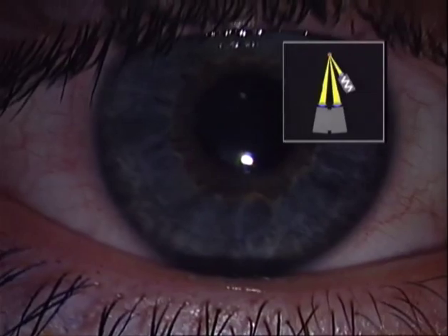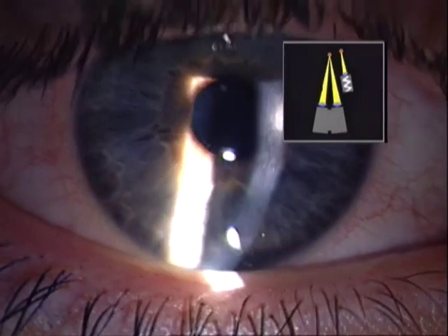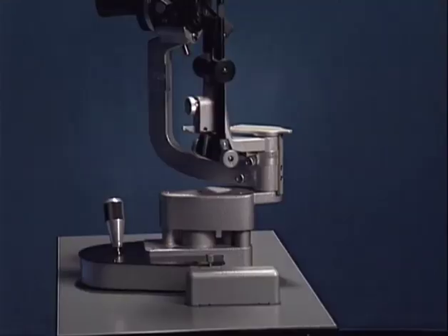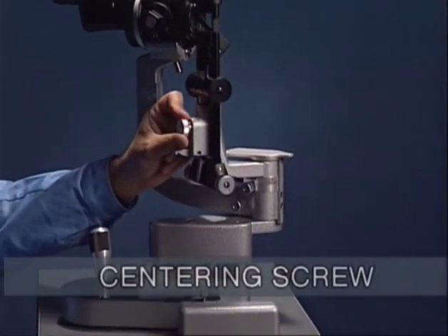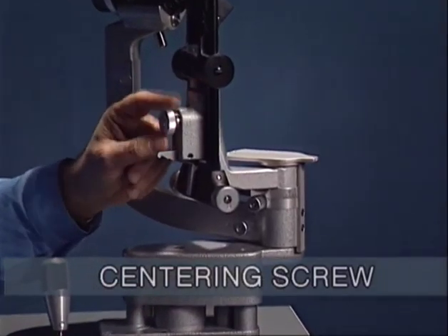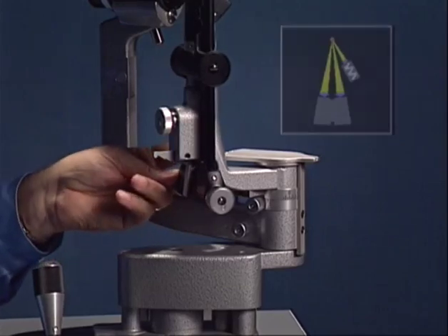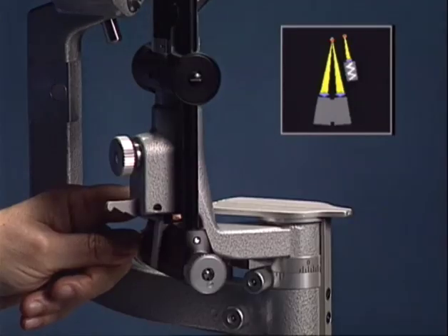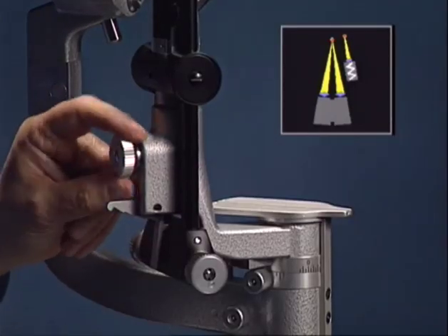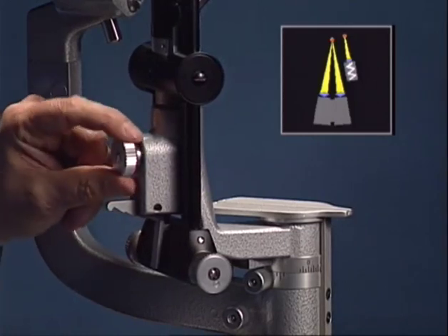There are situations in which the focus of the light should be set off-center, for example during examination in indirect light. How is the focus of the light beam set off-center? First, the centering screw is loosened. This allows a swiveling motion of the illumination unit, and so the slit can be set off-center. This is shown in the graphic. For recentering, the screw is fastened again, and then the illumination unit will automatically return to the position of coincidence of focus.